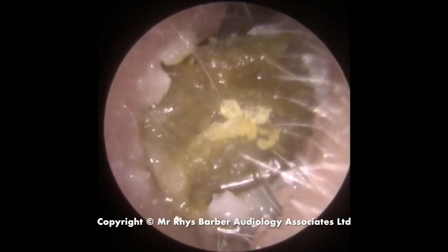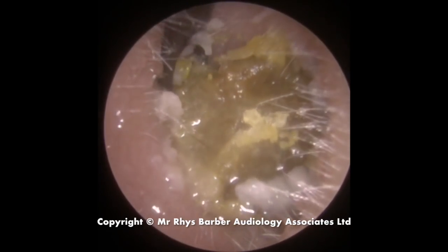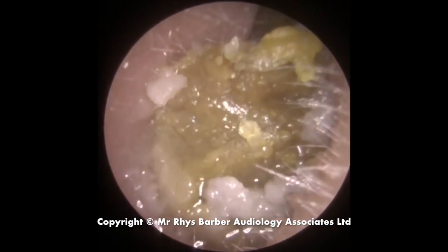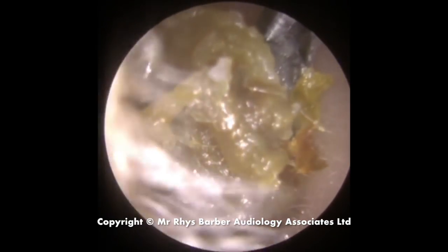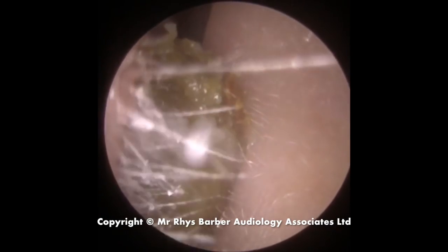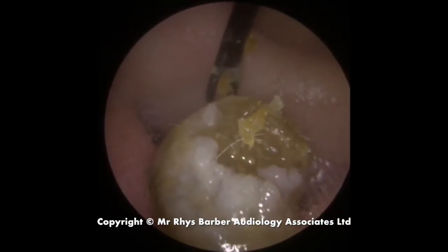With the Jobson horn we're just going over the top of the wax, bringing it forwards, slowly working this wax out of the ear canal. The white material you can see is just a little bit of skin. There we go — out it comes.